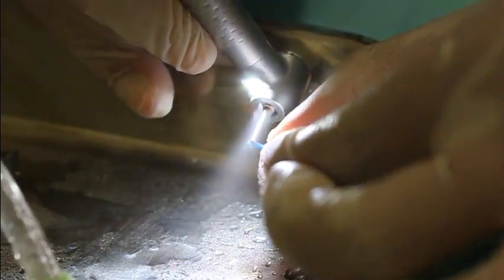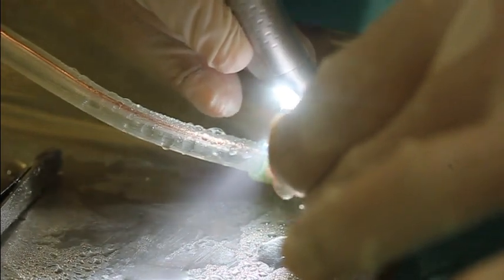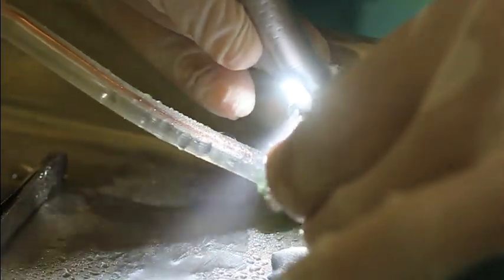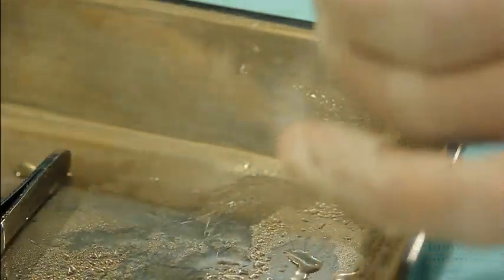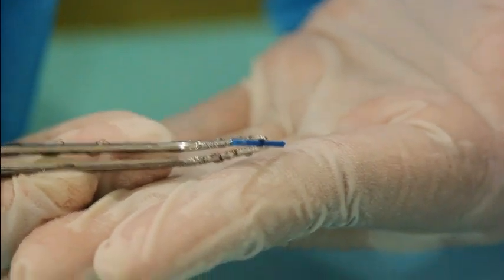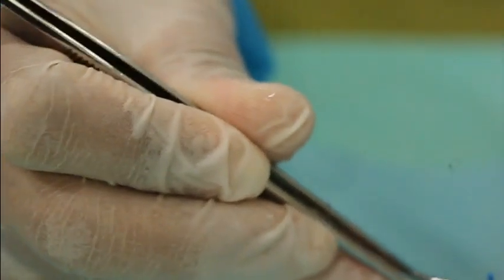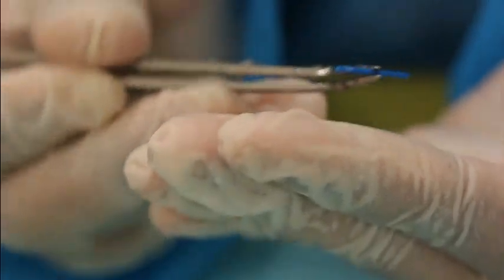Just use your bur. Serrations are only on the coronal part of the post, the head of the post.